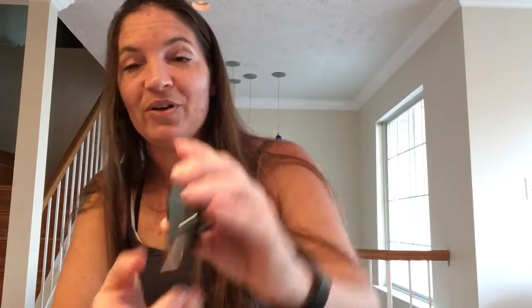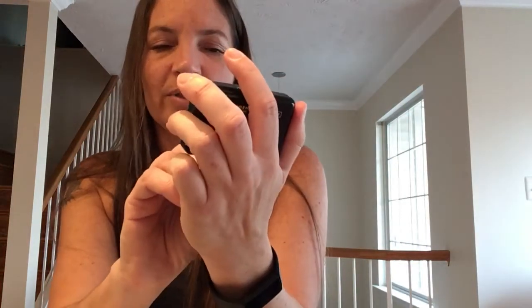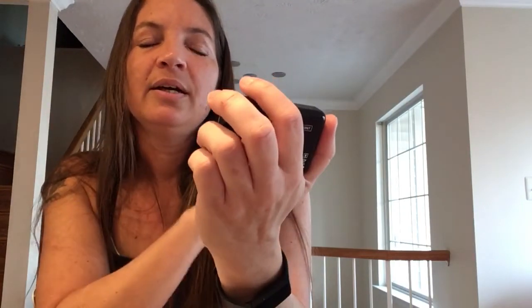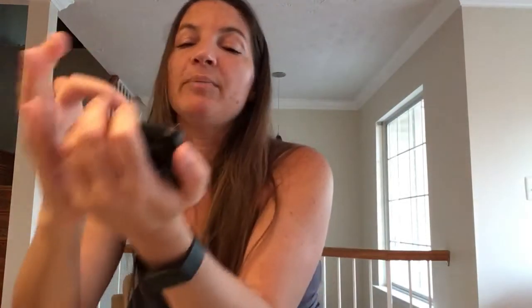Under that is sound volume. This is not the same thing as the Control IQ menu — they are located in two different places and have different functions. Sound volume contains your global sound settings for your entire pump. For instance, for all pump alarms — you can set all pump alarms to come out at a certain volume or to vibrate, and you can go through each category: pump alarms, pump alerts, reminders, and decide what volume level or vibration you want for each category of notification.